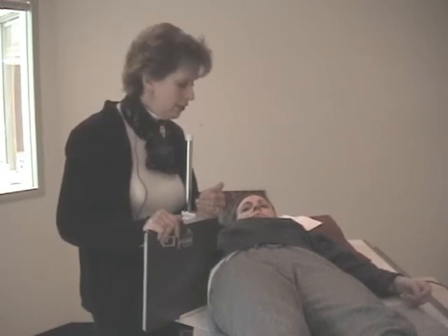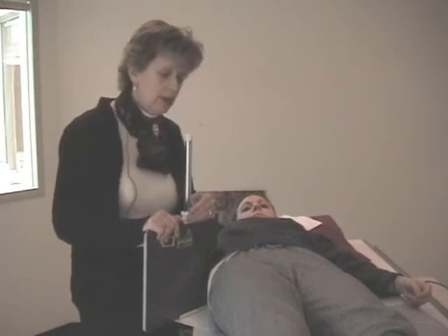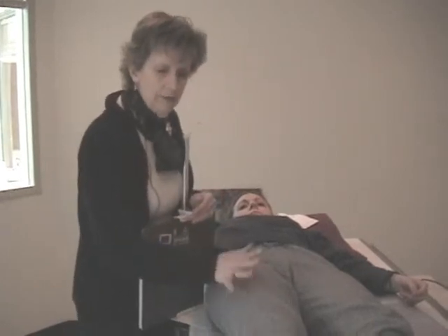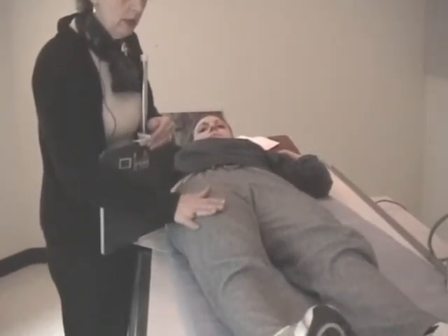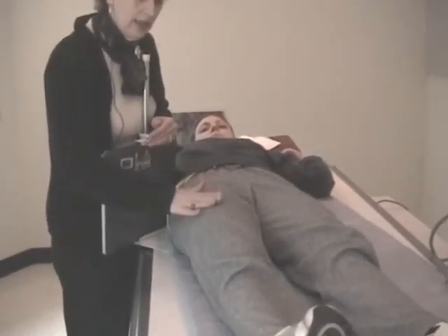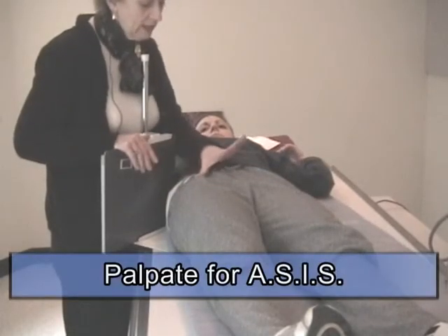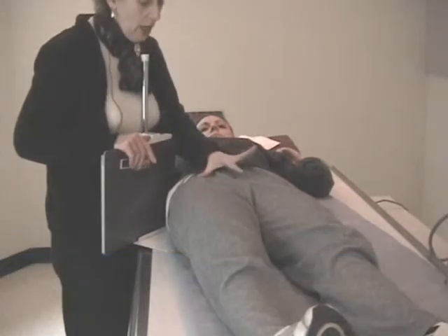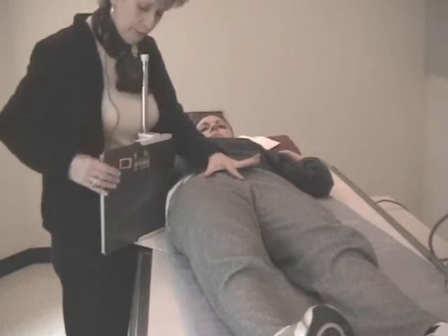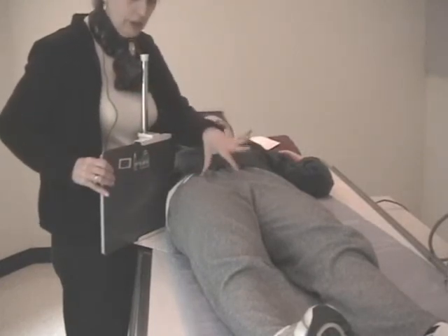So we're going to get down to some specific details now. Let's focus in on the patient's pelvis. The right leg, for demonstration purposes, is the injured leg. We're not going to touch that injured leg at all. But I need to palpate for the ASIS, and I draw that imaginary line again: ASIS, upper border of the pubic bone. That's where I'm going to put the plate. The film needs to be perpendicular to that imaginary line.